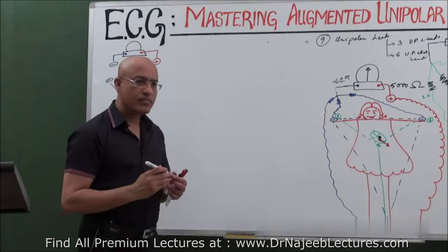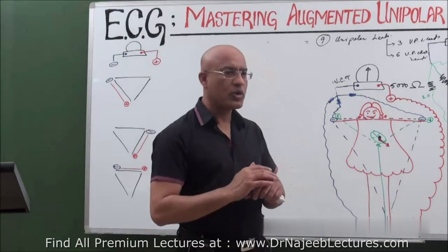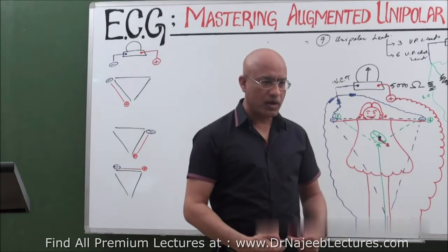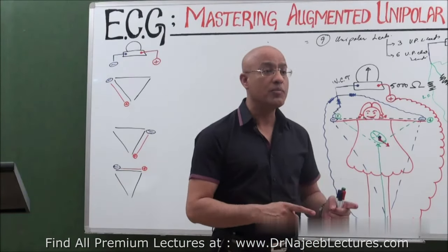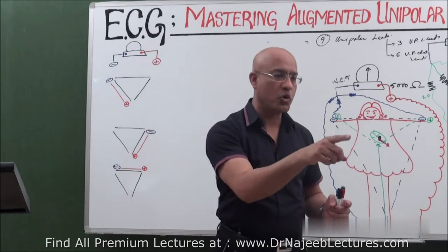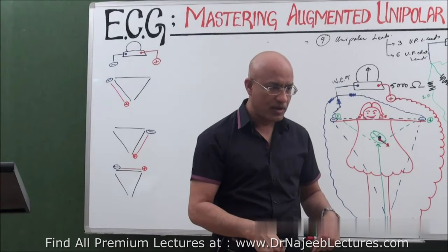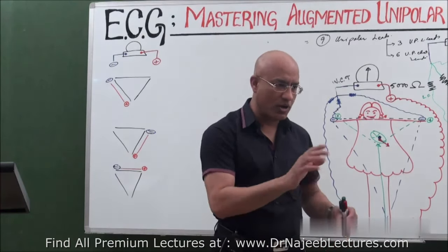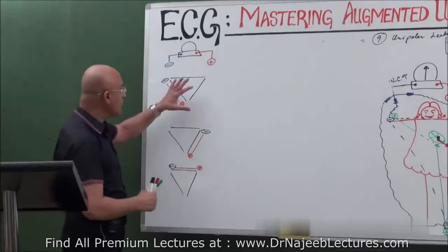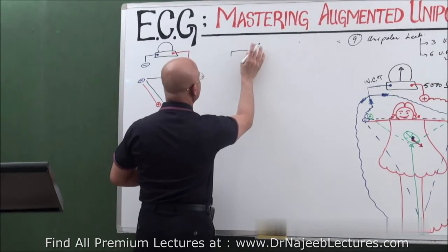Yes. So in the last lecture we told that there are three unipolar leads, three bipolar leads. Yes, in the limbs, listen. Total leads are 12, right? These days we have three bipolar limb leads, three unipolar limb leads, which are augmented unipolar. I will tell you later how Wilson's leads were augmented by Goldberger. Listen. So three are bipolar leads on the limbs, there are three unipolar limb leads and six chest leads. So all of them total? 12. We'll go to that later. This system, you understand? Now we'll compare it with the Wilson system. Again, here what have we achieved? Okay. Yes.